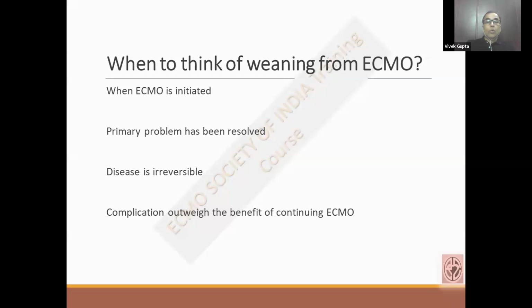to VA. So when should we think that a patient is to be weaned? The first thing we should keep in mind is that whenever we put a patient on ECMO, weaning should be thought of from the start. So once you have initiated the ECMO, it is time to start thinking about how you are going to wean this patient, what your strategy will be, and that will keep changing or altering depending on the patient's condition. But at least you should have some roadmap in your mind once you have initiated it.